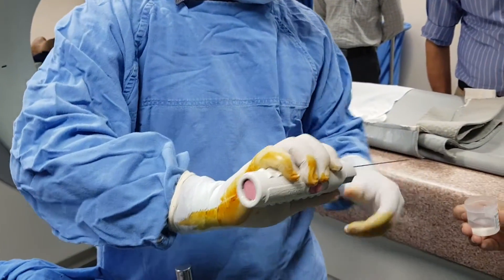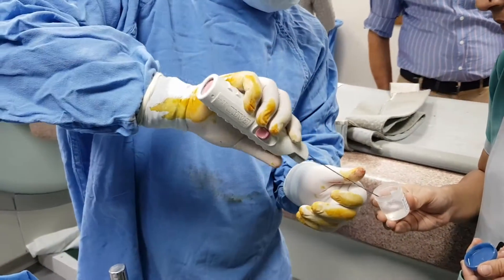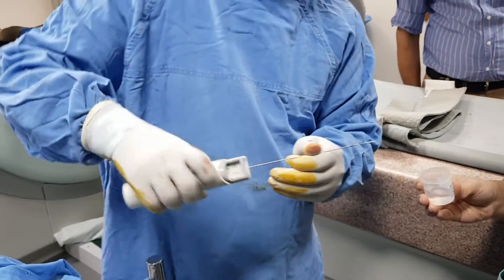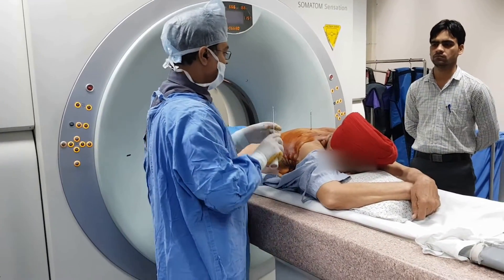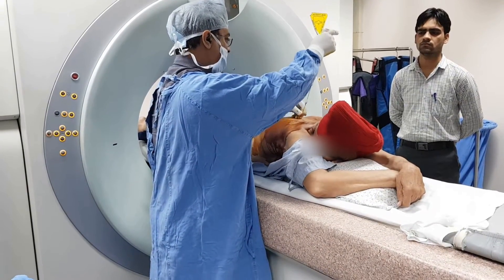Last time I was a little less careful, so it fell back. You can see — hard tissue. It is bending. I will take a little bit now and let him breathe also.